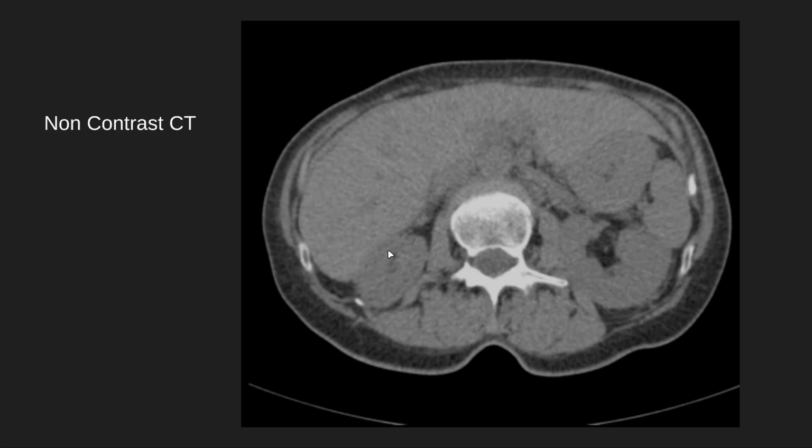And you can tell this is without contrast because you have here the aorta, the abdominal aorta, you have the kidneys, you have the liver. If you notice, none of them are enhanced by contrast. None of them. They're all soft tissue density. And you have the bone here, which is always bright. But in general, you can tell by this CT, it is non-contrast enhanced.